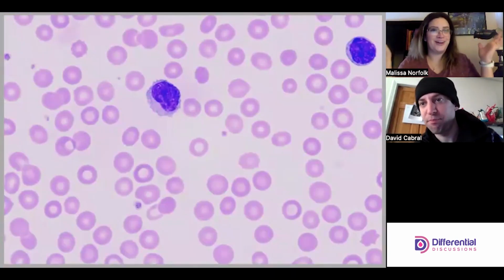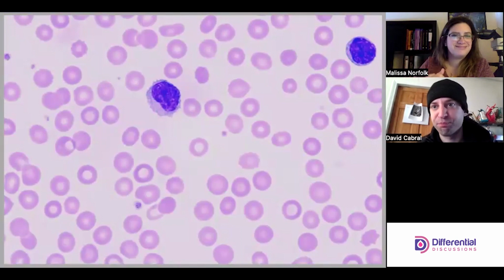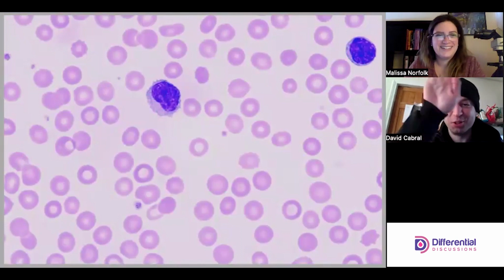Okay, so here we are on 100x. You can see we found some nice lymphs. I'm going to move my Melissa's face. I'm having a hard time. Say that again, Dave. I had a hard time hearing. Sorry, yeah, I was moving your face out, your face was over the lymphocyte.